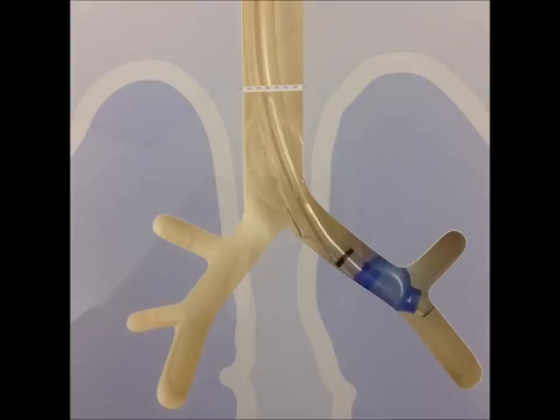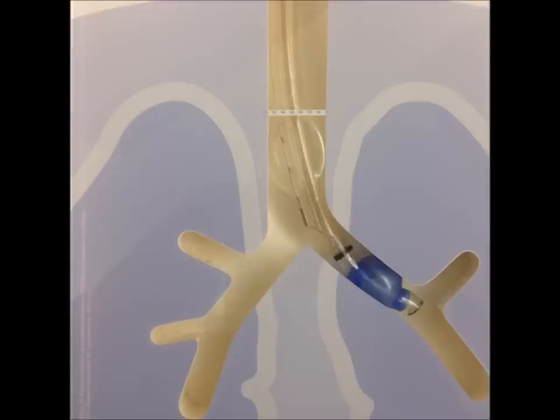Here's a tube which has been advanced too far perhaps during the move, and you're really only going to ventilate just the left lower lobe. You're going to have real high peak inspiratory pressures. You cannot ventilate through the tracheal port because it's down the left endobronchial side. This tube has been pulled back and here it is still too far down. You can ventilate both sides here, but your tracheal port is really past the carina.